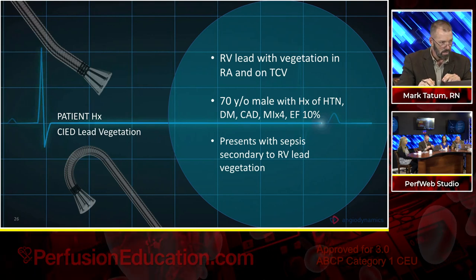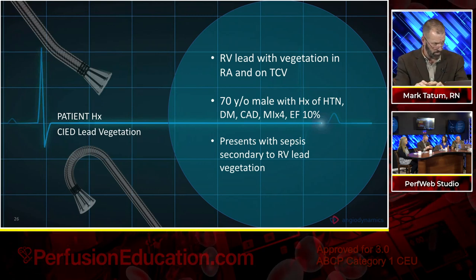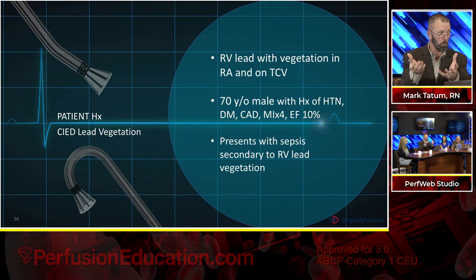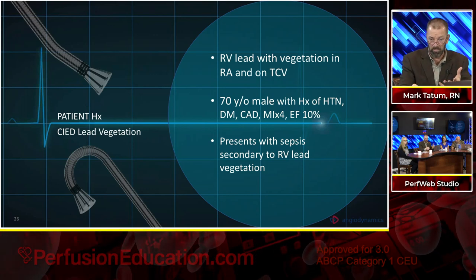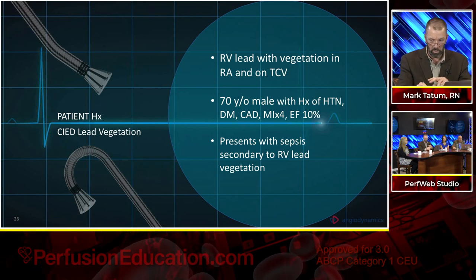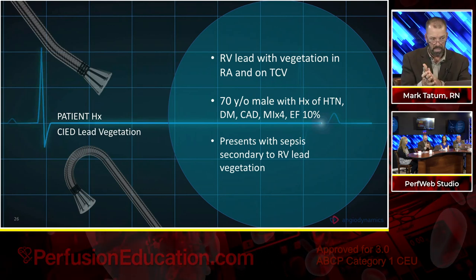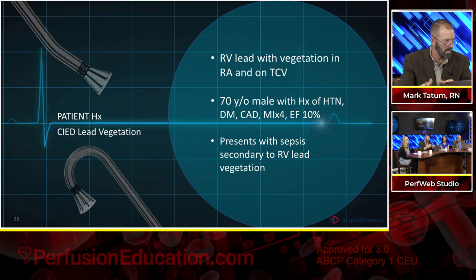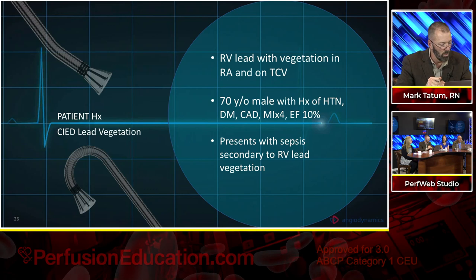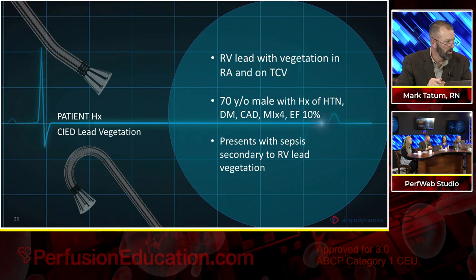The AngioVac cannula performs better in patients who are relatively wet. They are intravascularly full. We are a flow-mediated device. We have to have flow in order for this thing to work. And in order to do that, to the degree that the patients will tolerate it, we want as much fluid on board as they can maintain inside the vasculature without causing any kind of issue. Well, somebody with an EF of 10% is going to be very volume overloaded. They are going to be volume overloaded. They're not going to be alive.